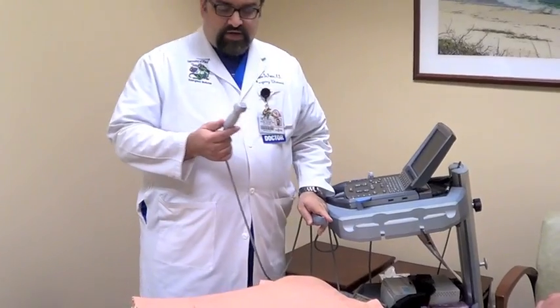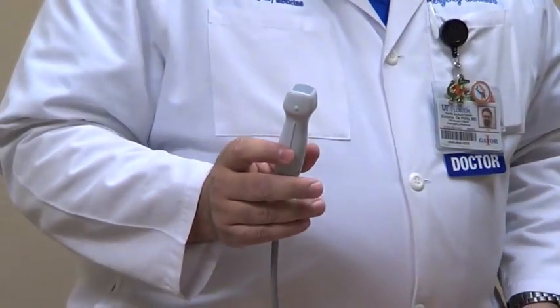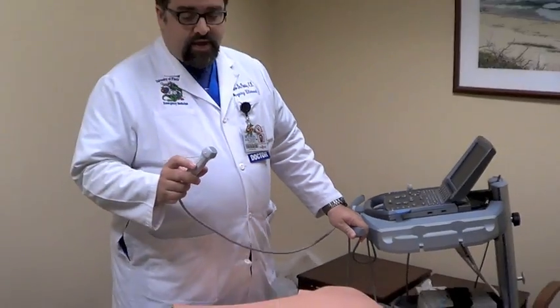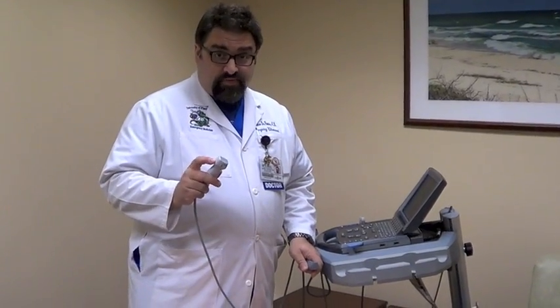You want to use your phased array, the P21 probe, 5 megahertz probe. And depending on if you're doing a FAST exam or a cardiac exam, it will depend which way your probe is going to be pointing.